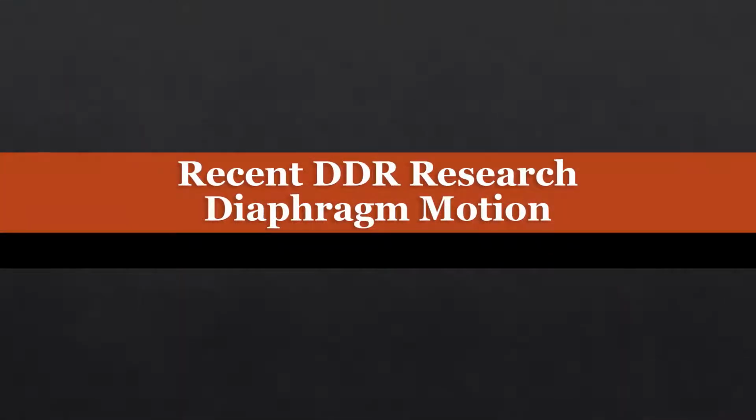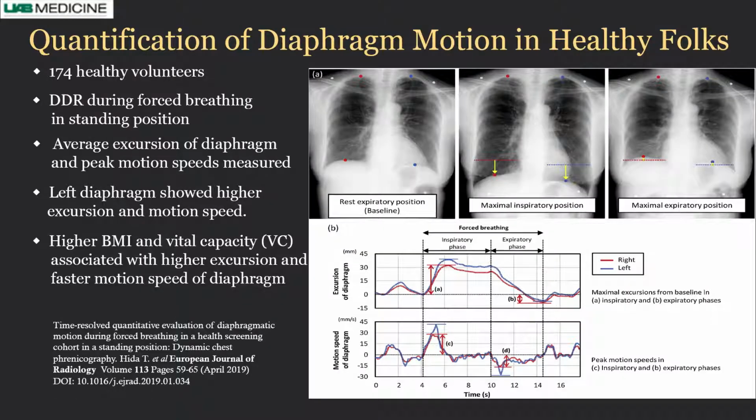What about the research? We talked about diaphragm motion. This study looked at diaphragm motion in healthy subjects. There are 174 healthy volunteers. They looked at both diaphragms. You can look at the diaphragm by their movement. You can tag it with the dots here or put lines here.